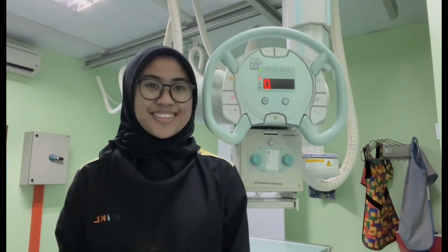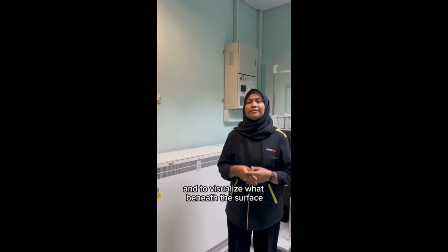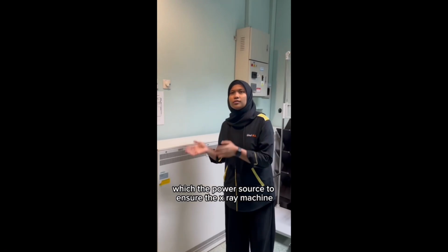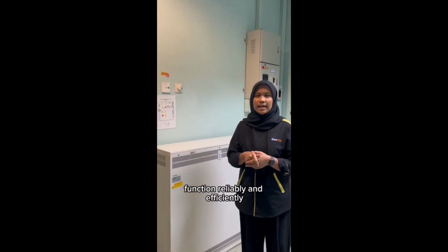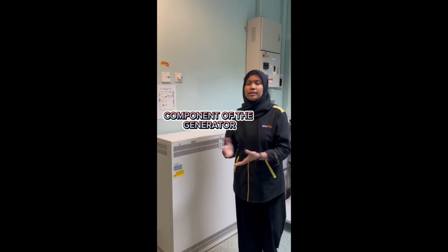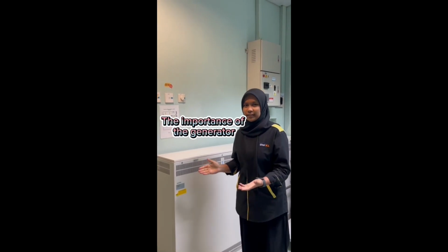Thank you. In an X-ray room, we rely on advanced technology to visualize what is beneath the surface. At the heart of it all is the generator, which is the power source that ensures the X-ray machine functions reliably and efficiently. In this presentation, I would like to tell you the components of the generator, how the generator powers the X-ray machine, and the importance of the generator.